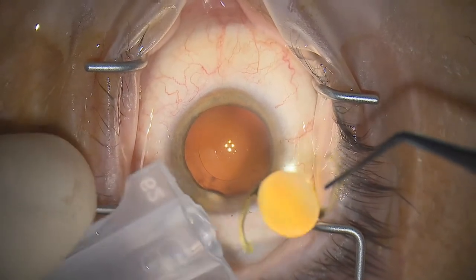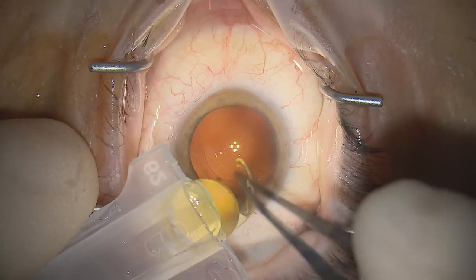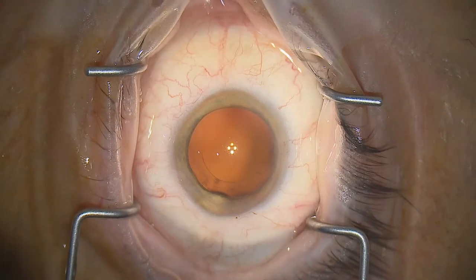Seeing that again in slow motion: filling the cartridge so the viscoelastic is spilling out at the end is very good because it stops the optic of the lens sticking to the naked plastic on the way in.